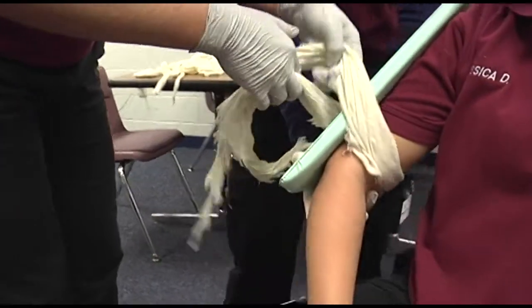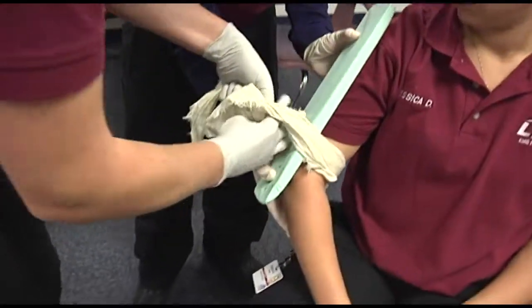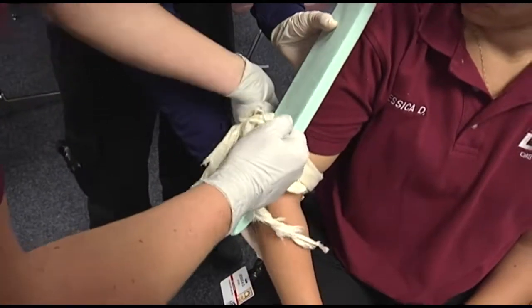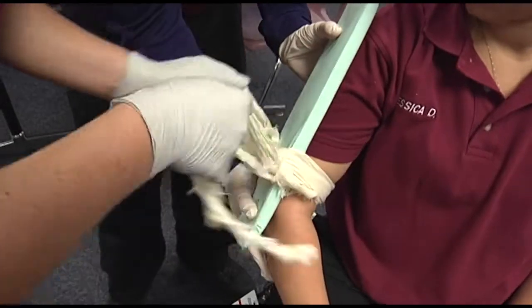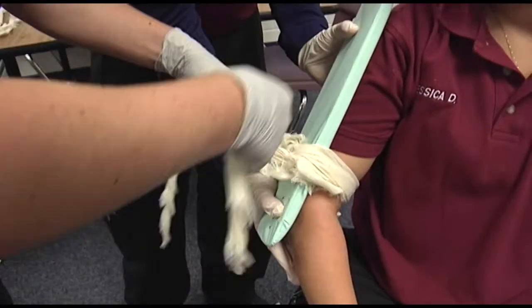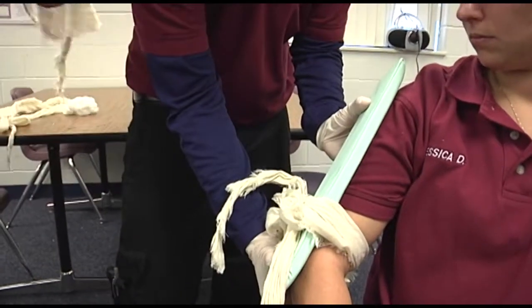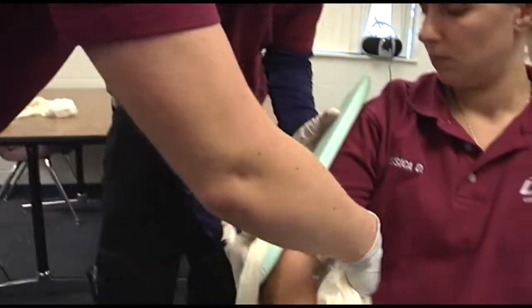The first EMT would straighten any severe angulation with gentle longitudinal traction above and below the fracture site, and remain stable until the splint is applied and fixed by the second EMS provider. Remove any rings or jewelry from the affected extremity.